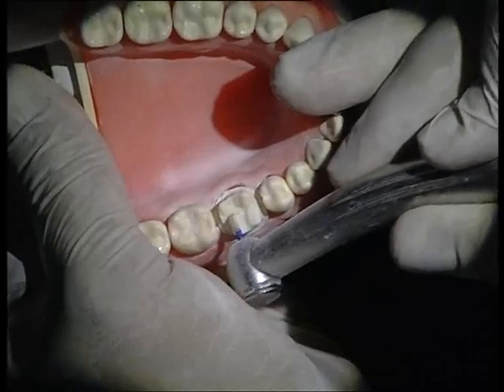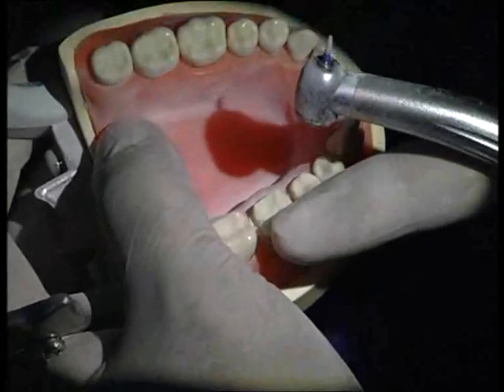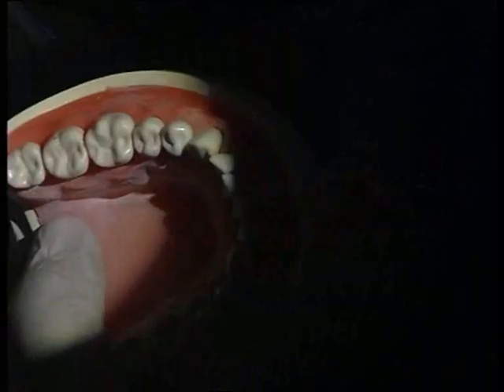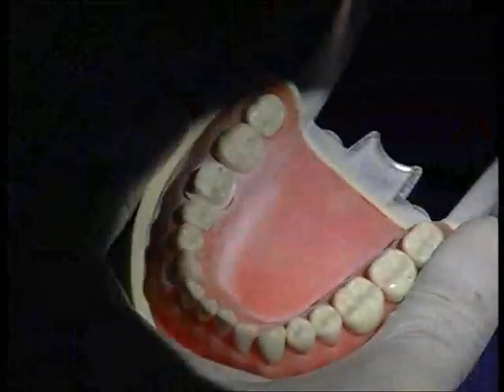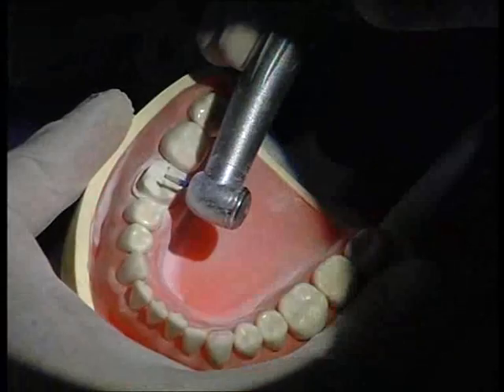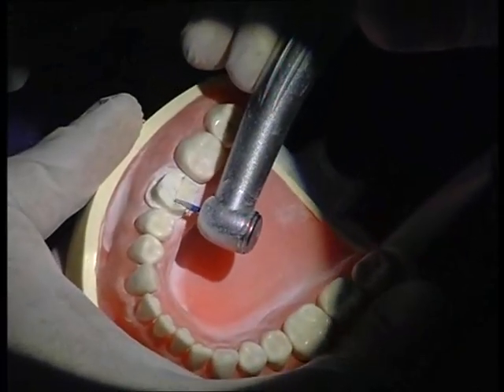Always follow the inclines that are already presented by the tooth. Suppose this was a patient who used to clench — his inclines are flattened out — so you will simply follow the same incline; you will not create a cusp tip. Just follow the incline that the tooth automatically gives you. You will do the same thing for the lingual. For the lingual, understand that because this is a non-functional cusp you do not need as much occlusal reduction — comparatively less than the buccal — but again the same principle: one cusp at a time.